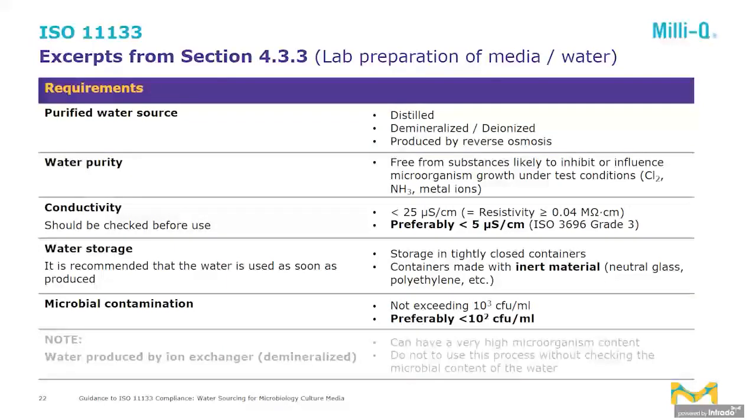Another very important topic is the level of microbial contamination. So that seems quite logical that there should not be too much microbiological contamination in the water that you will use to prepare your media. So it should not exceed 10 to the power 3 CFU per ml, and preferably it should be inferior to 10 to the power 2 CFU per ml.